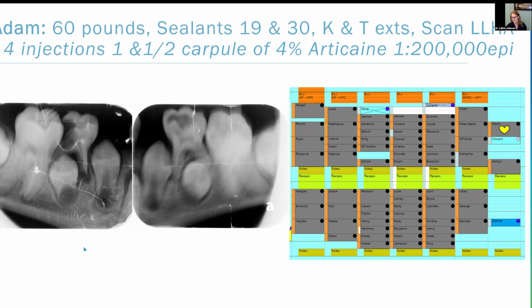This is a child with sick teeth. Sick teeth have a lot of mottled bone around them, which makes it easier to get into the bone, but you don't want to inject into a space that has a radiolucency. So we did multiple injections here. And I want to point this out because it's really important. I wasn't really happy with the amount of infection back here and obviously the bone. So when I injected here, I aimed a little bit further down the ridge. And we know, particularly in the mandible, when we're up on the crest, the bone's easier to get in. The more you descend down the mandible, the more organized and highly corticated that bone is. But I was actually able to inject down here. So I gave that injection, that one.